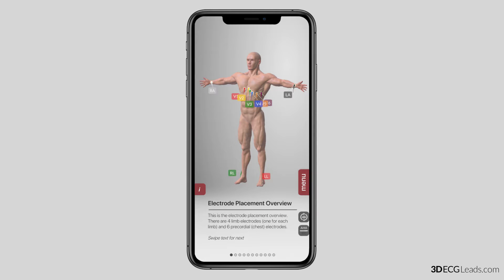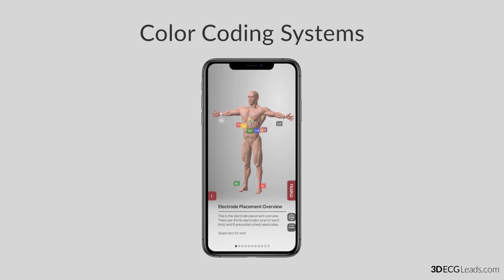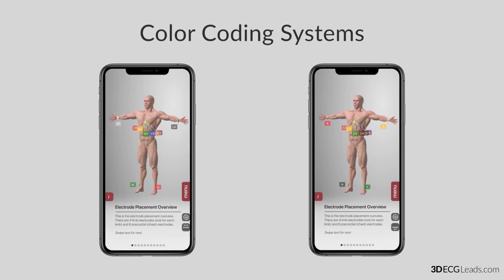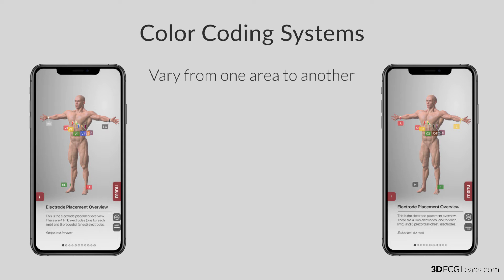These 10-wire leads come in two major standard colors and names, also known as the color coding systems. The color coding systems vary from one area to another. They are known as the American Heart Association, AHA, which is used in the USA, and the other is the International Electrotechnical Commission, IEC, which is used in Europe.